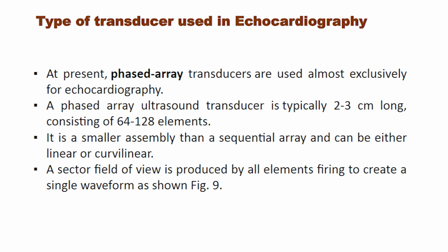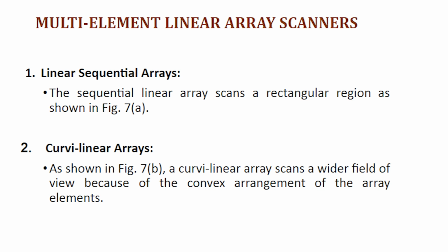A sector field of view is produced by all elements firing to create a single waveform, as shown in figure 9. Now we will see multi-element linear array scanners. First one is linear sequential arrays.